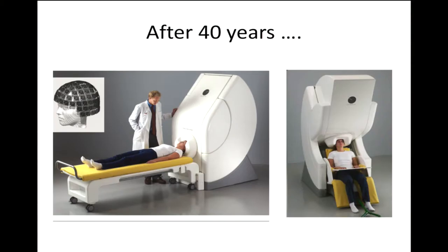And you can see you have two versions. You can lie down or you can sit, and you have to make sure that while you record, this is where the pickup coil is, inside the helmet. This helmet has to fit your head as close as possible, because if there is any gap or it doesn't fit well, you don't pick up the magnetic field properly. Your data would be quite unreliable.